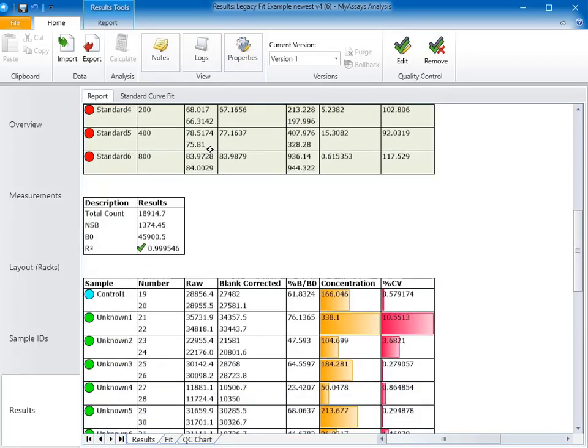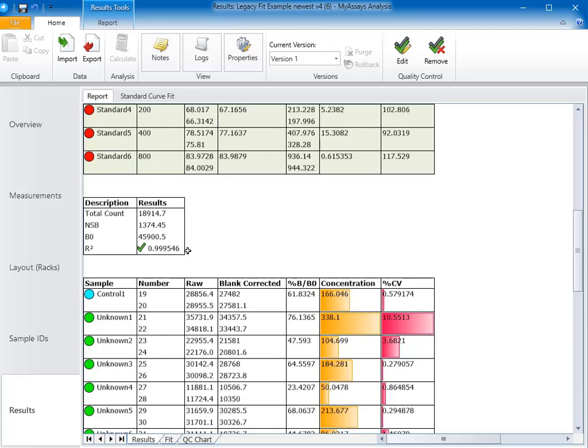We also have an evaluations table to report our total count, NSB, and B0 CPMs, as well as the R-squared. I've added an evaluation label to the R-squared row that will enter a pass symbol if the value is greater than 0.985, and a fail symbol if the value is less than 0.985. So in this case, our R-squared is acceptable.